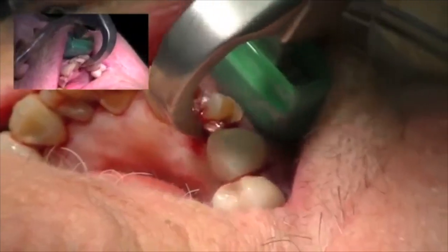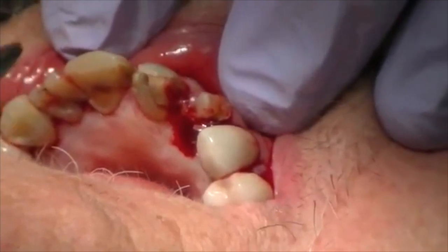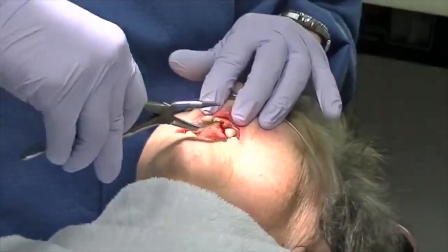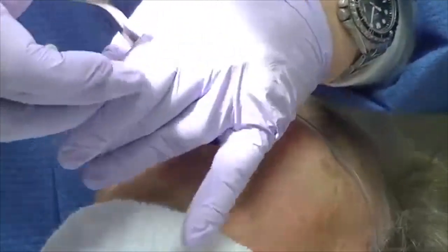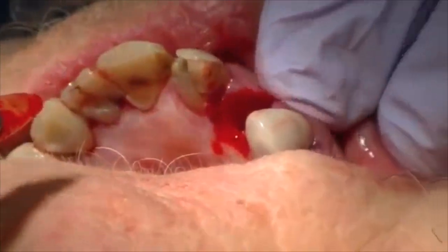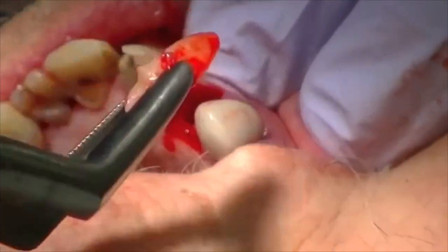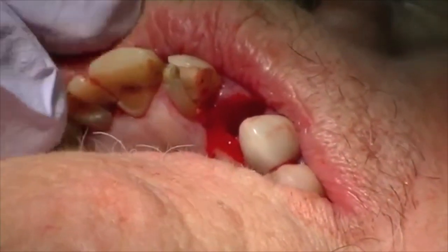You can see the tooth has moved up and out of the socket. Now there's a tooth delivery instrument — it's simply a forcep that has teeth on it, kind of a bird-beak type. What I'm doing is engaging the tooth and rotating, trying to elevate that tooth out of the socket without damaging the buccal plate at all. The buccal plate is totally intact, so if you did want to place implants in this area, you have facial bone and mesial-distal bone. It's a really nice extraction — just take your time with this forcep; it's not intended to go fast like a conventional forcep.